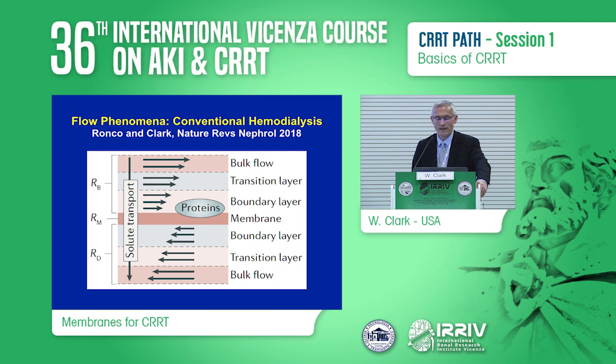And then within both the blood compartment and the dialysate compartment, those can be demarcated into so-called bulk flow and boundary layer flow. Now, the boundary layer is an effect of the viscous drag forces that I mentioned before. And if you want to conceptualize the mass transfer resistance, it almost entirely resides in that boundary layer, at least on a mathematical or conceptual basis. And the same can be said for the boundary layer in the dialysate compartment.